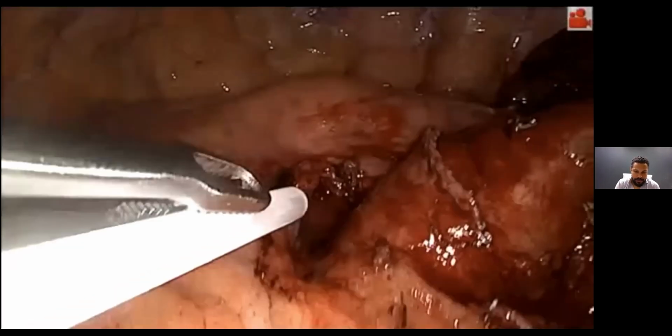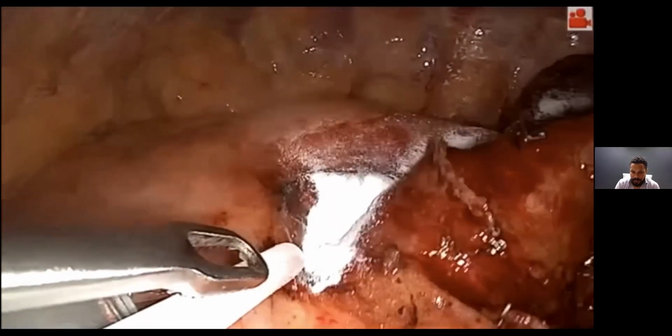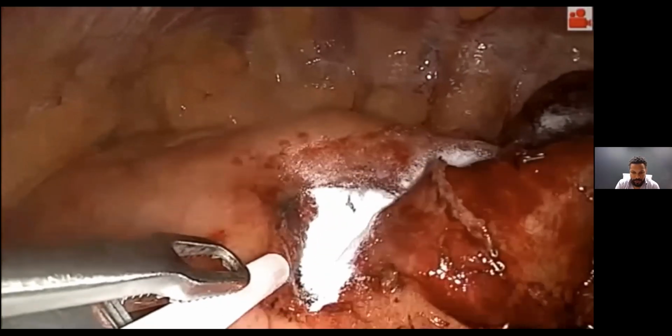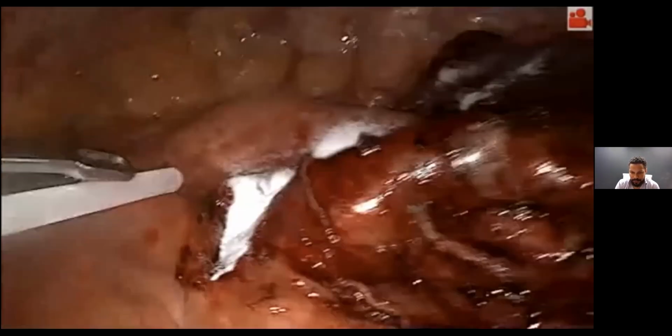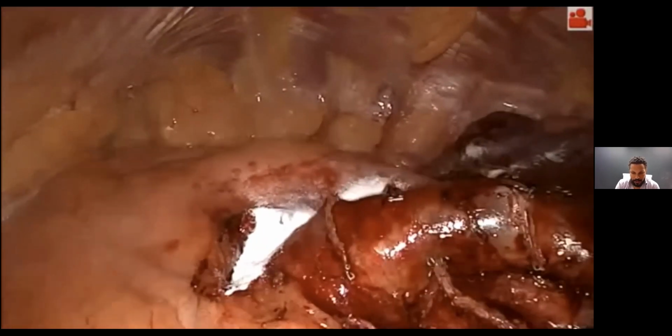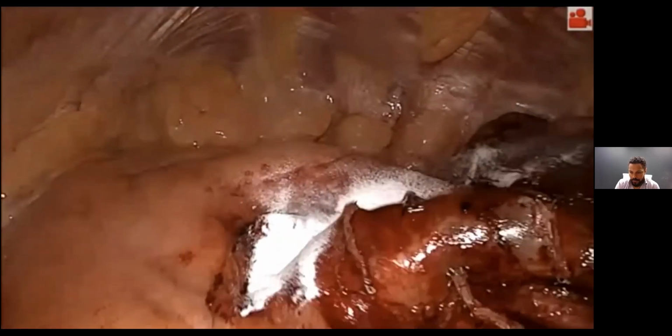Another example here for left upper lobectomy, again fissure-less. So again, a bit of oozing at the end of the surgery, and we have more and more patients with antiplatelets or anticoagulative treatments. So we try to decrease the risk of oozing and the blood output within the 24 hours following the surgery.